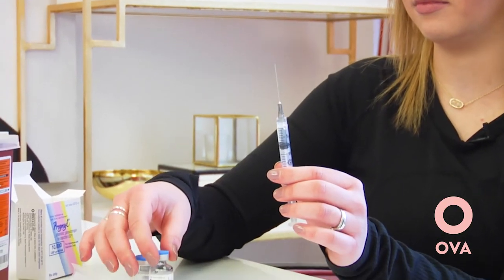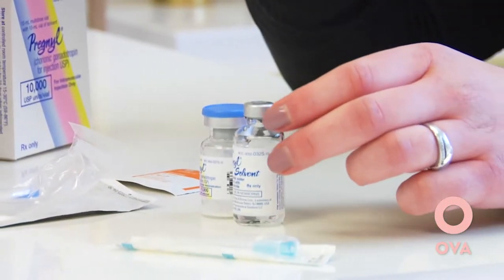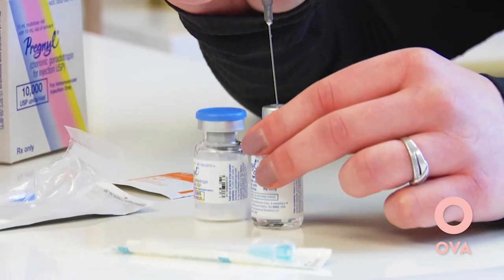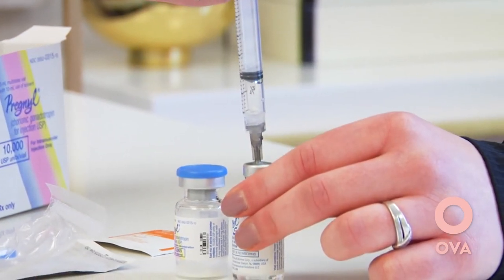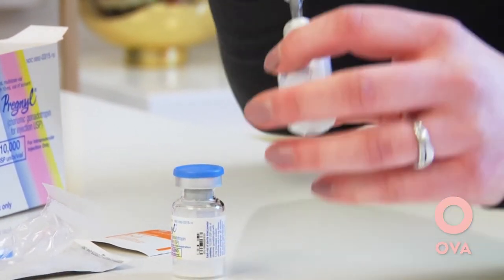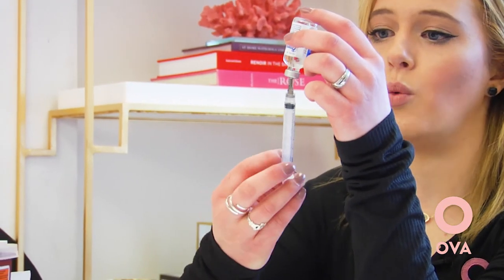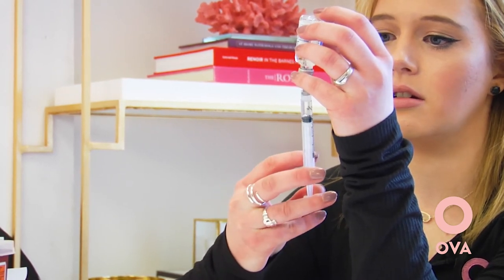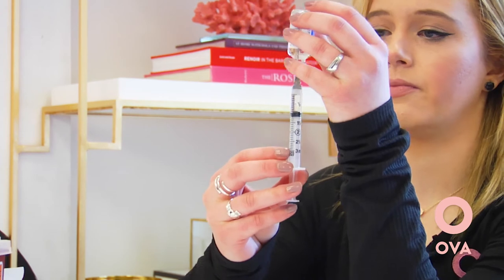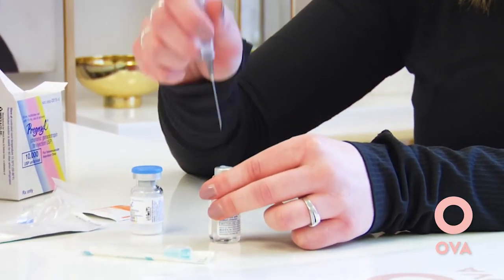Then you're going to uncap the needle. Take this cap off and inject the one cc or one milliliter of air into the water. Push the needle all the way in, inject the air, then flip the water upside down and draw back one cc or one milliliter of the water. Set it back down and pull it out.